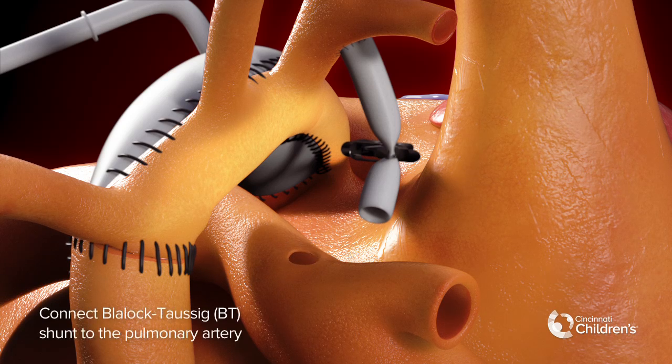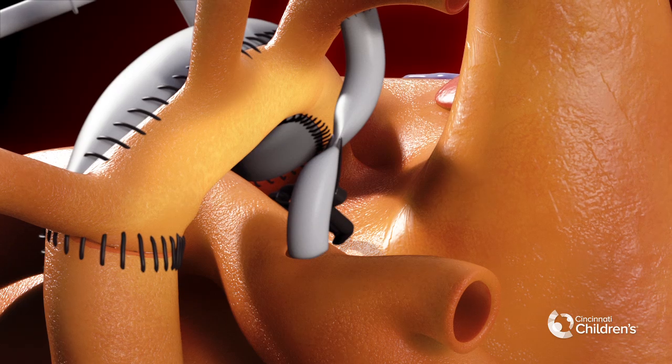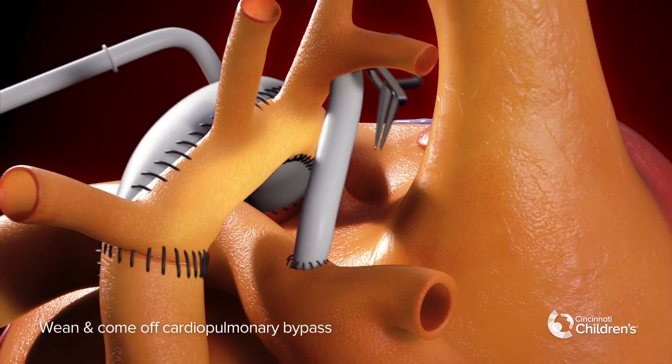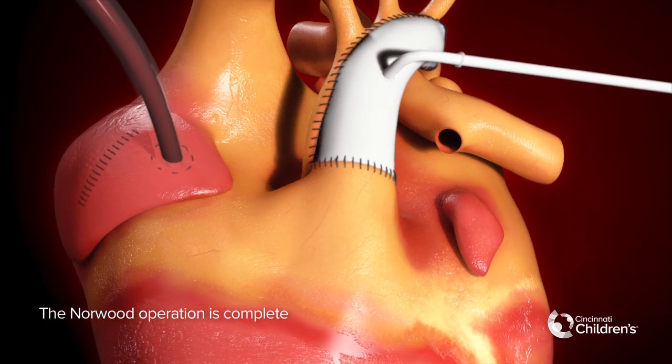Connect the Blalock-Taussig BT shunt to the pulmonary artery. The BT shunt will control pulmonary blood flow. Wean and come off cardiopulmonary bypass. The Norwood with BT shunt operation is complete.